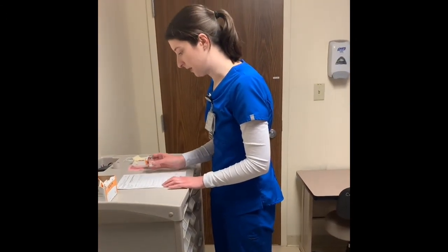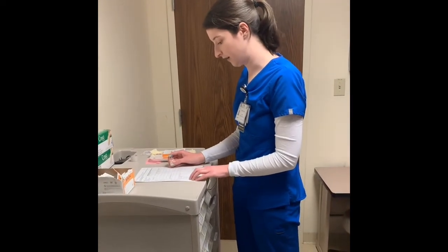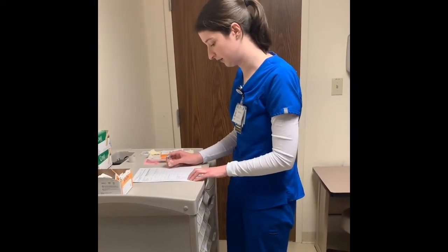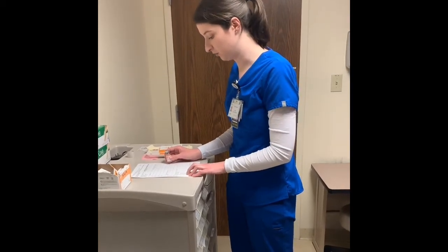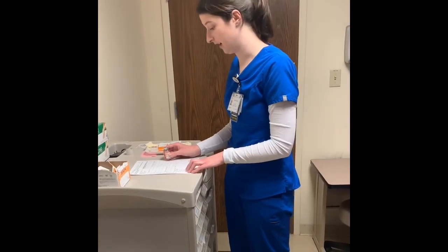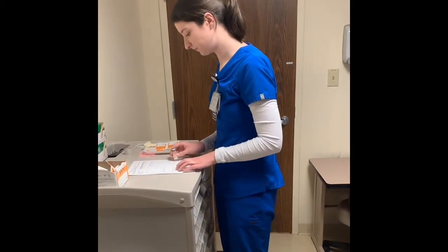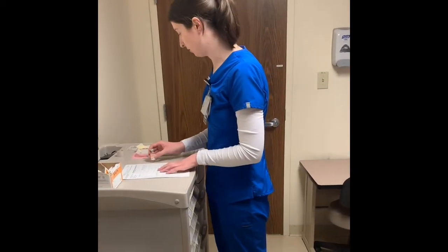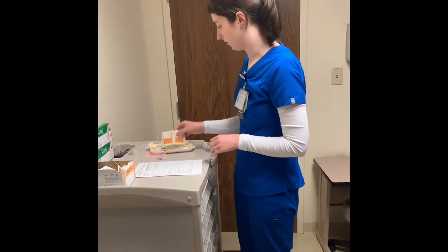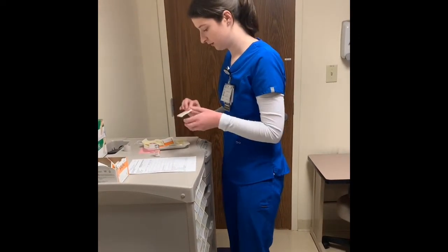Based on the patient's most recent finger stick blood sugar level reading of 355 and the sliding scale for regular insulin administration that I have provided on my MAR, I will be administering 20 units of regular insulin at this time, and the current time is 1100. All right, so now I'm going to go ahead and prepare my medication for administration. So I'm going to start by cleaning off the top of my vial.